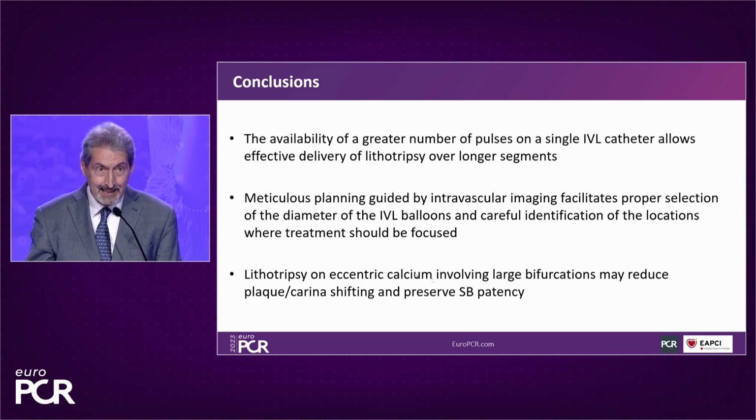And eccentric calcium is, of course, still a question mark. You may say, I can do with a balloon only. Personally, when you want to optimize the result, especially in a large bifurcation, my strong advice will be to take advantage of the lithotripsy energy. Thank you.